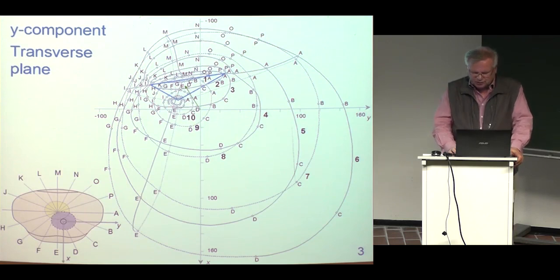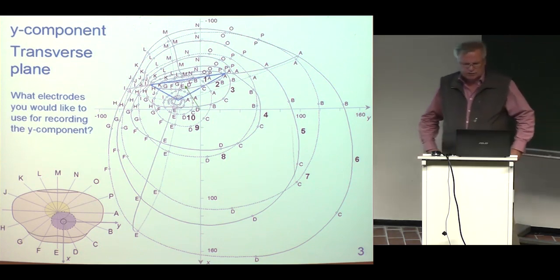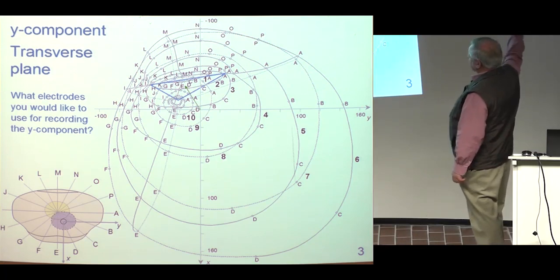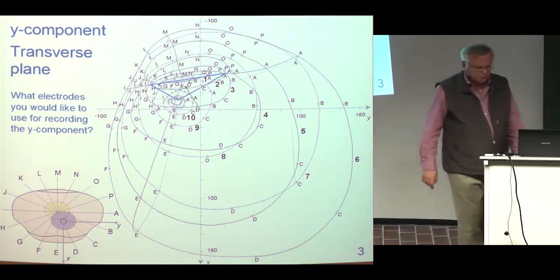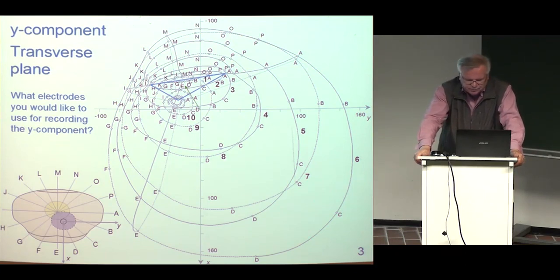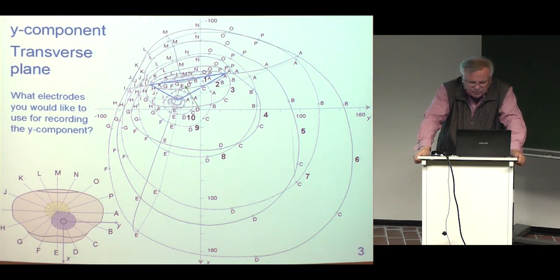So here is shown the Frank image surface, what Frank measured in the transverse plane. What electrodes would you like to use for recording the Y component? The Y axis is pointing in this direction, so to the left in the patient. Which electrodes would you prefer? Do you have any suggestions? You are so shy. Okay. Sorry? Number one? From where? Y direction, yes. But where is the electrode? On what level?